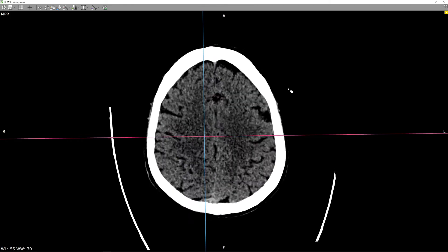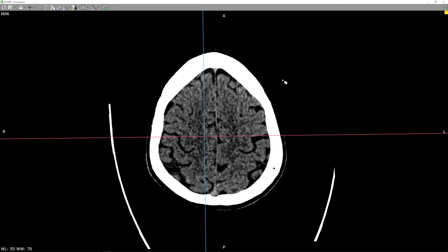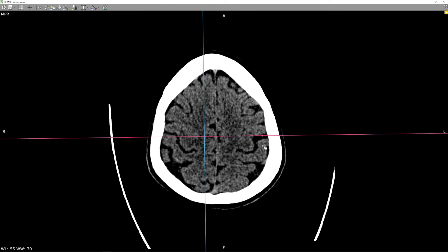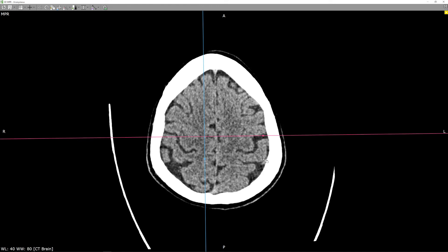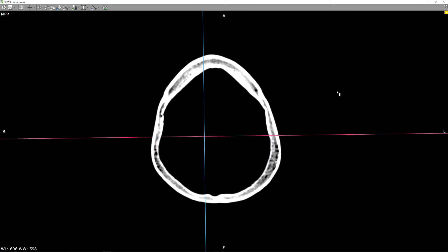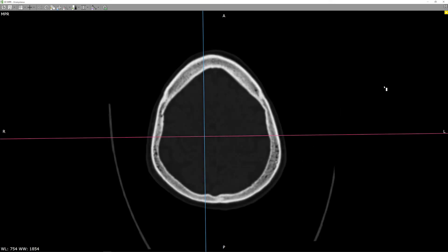It is important to correlate the patient's symptoms with the area of the infarct. For example, the precentral area is concerned with movement, whereas the postcentral gyrus is for somatosensory. Lastly, it's important to review the bones to look for any fractures.